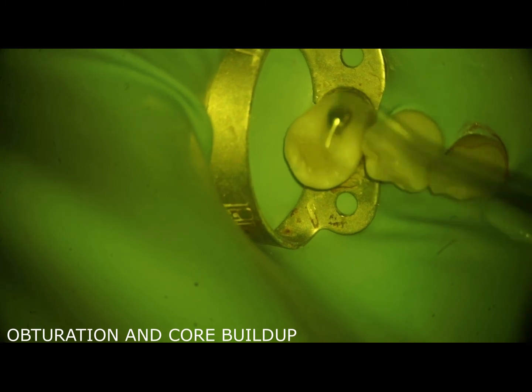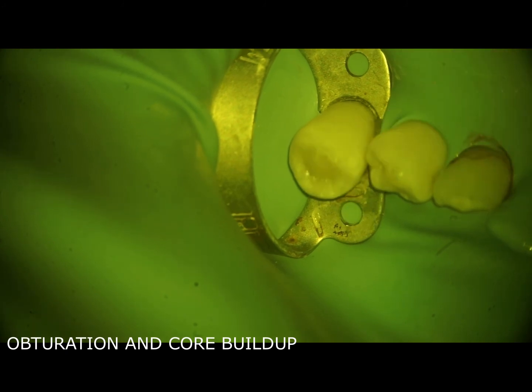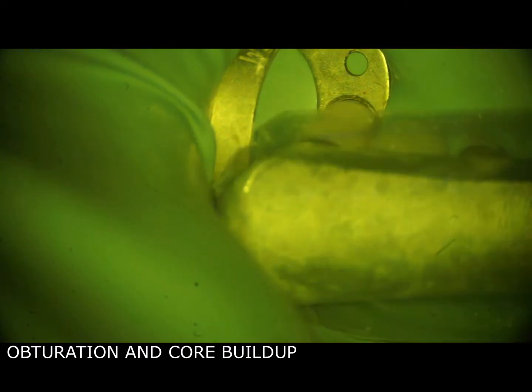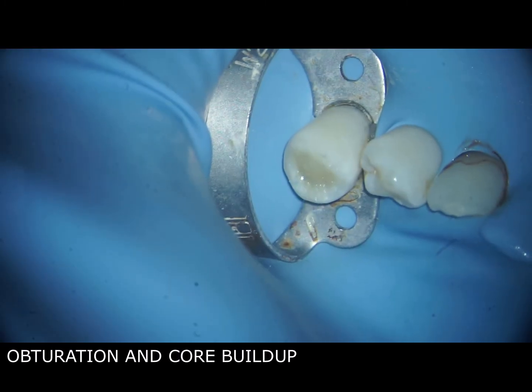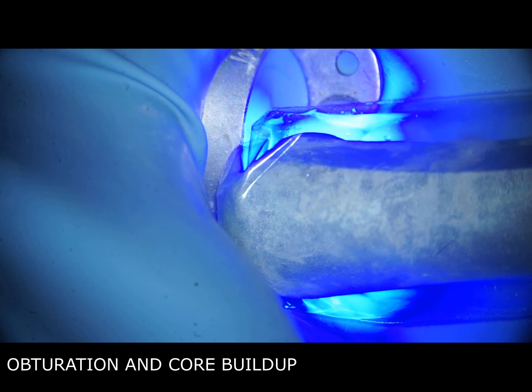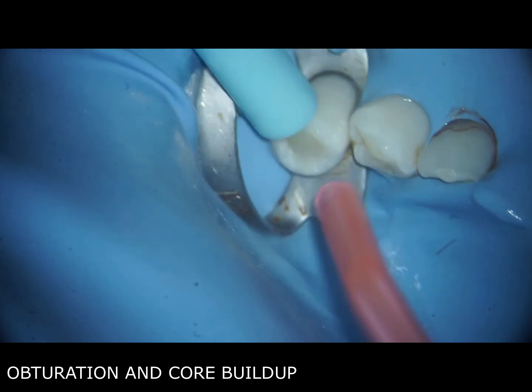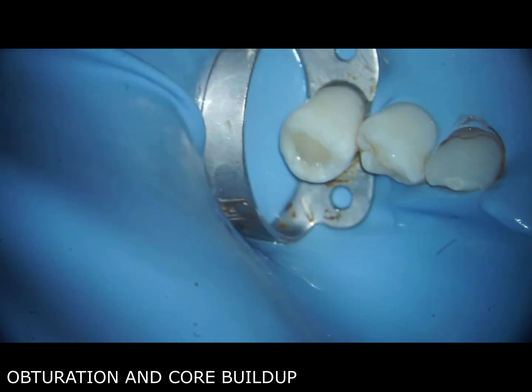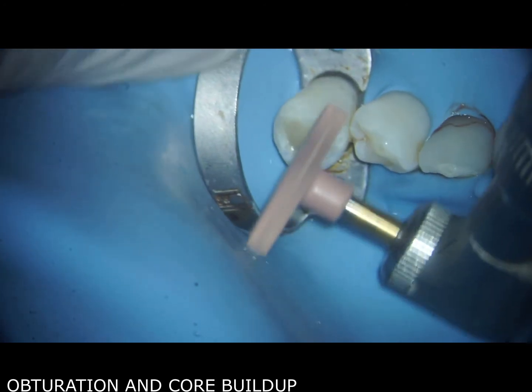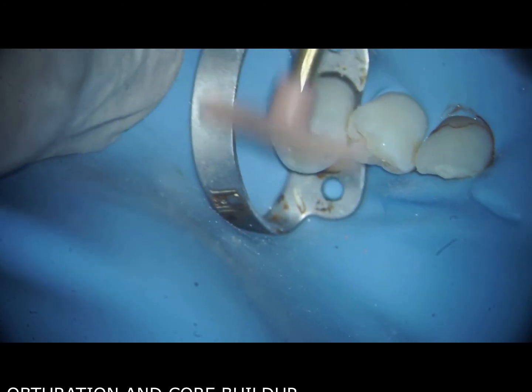Since the excess tooth structure loss was small, we do not prefer placing a crown — we only use crowns when a lot of tooth structure has been destroyed. We cure the composite; you can see how beautifully sculpted it is. We apply a layer of glycerine to inhibit atmospheric oxygen from stopping polymerization. After the restoration is complete, we polish it using Ivoclar discs to finally achieve a glossy, highly polished composite.